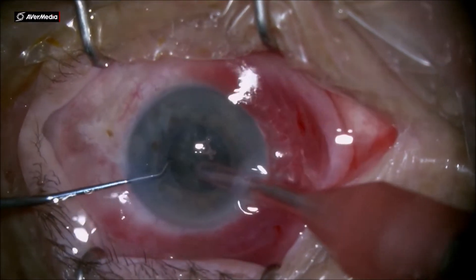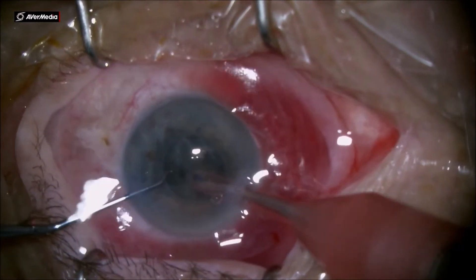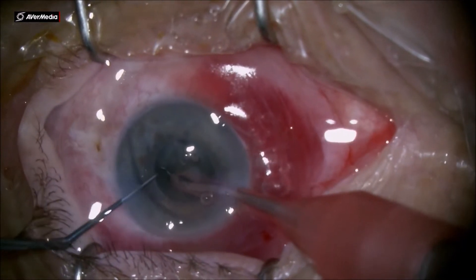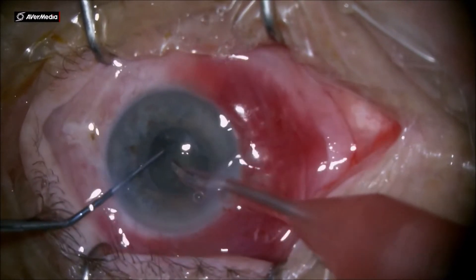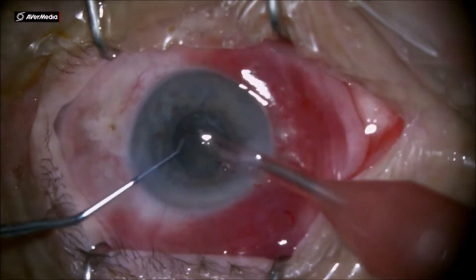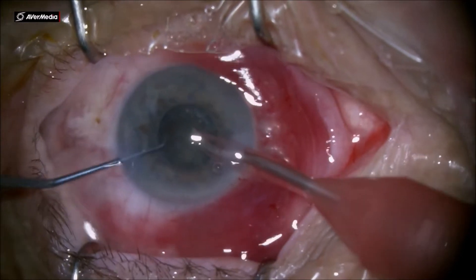Another small trench here and the second hemi-nucleus is divided into two quadrants, and from this point on the surgery becomes very easy.